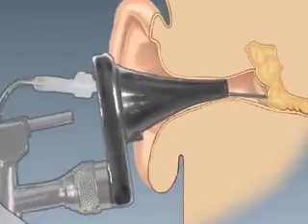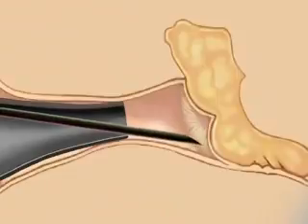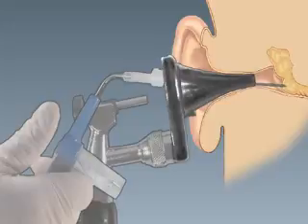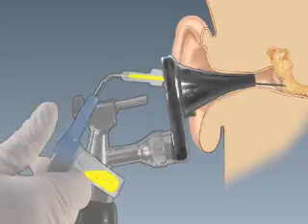Insert the needle tip through the inferior portion of the tympanic membrane 2 to 3 millimeters above its inferior rim. Immediately after penetrating the tympanic membrane, place your thumb on the orifice of the tympanocentesis aspirator and start suctioning the middle ear fluid. Once pus is visualized in the aspirator, promptly remove your thumb from the aspirator to avoid losing the specimen into the suction tubing.